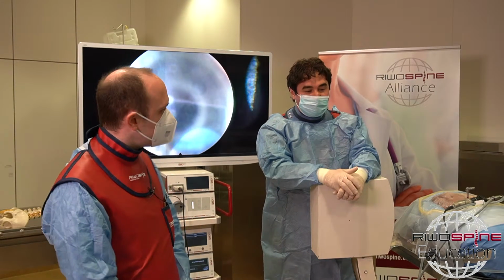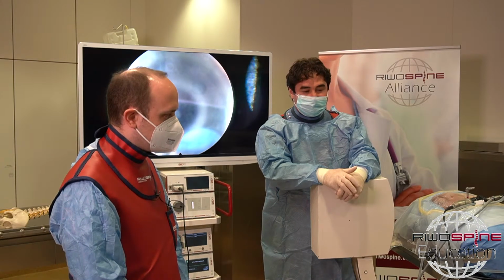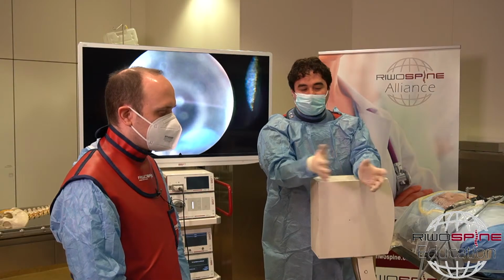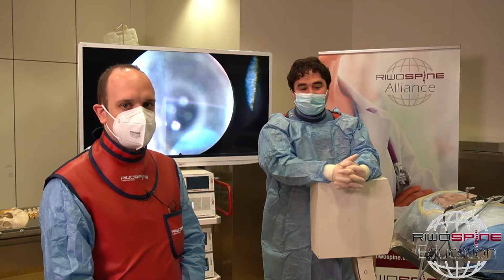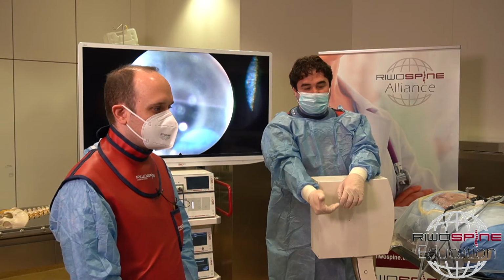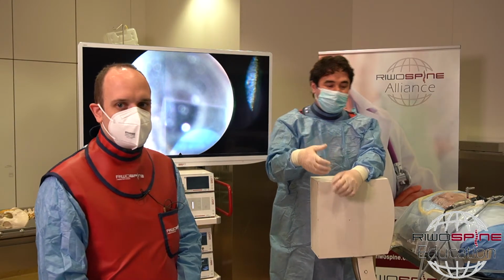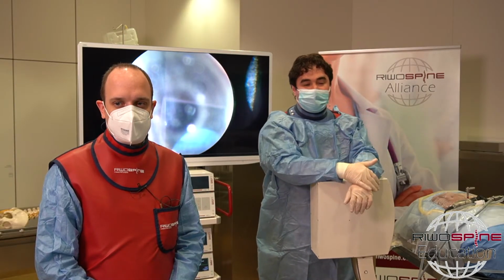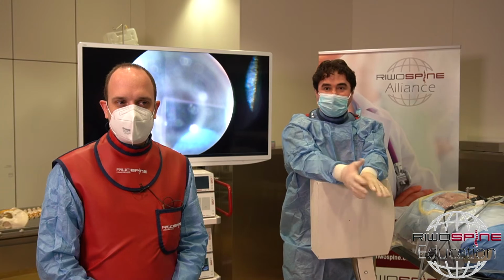Basically, I like the tube punch, because I feel it is stronger and you can cut the bone, but both of them are available. It's the same. With the tube punch, you always take the bone from the lower part to the upper, and with the regular Kerrison you cut it from up to down. But I'm used to working with the tube punch.